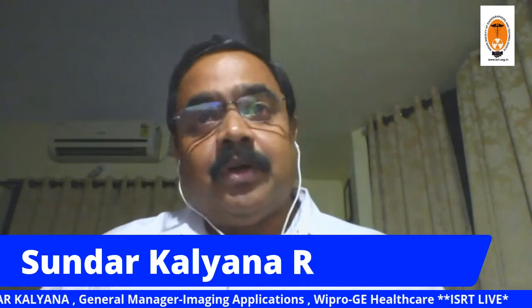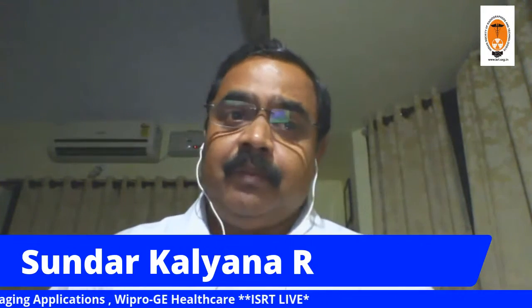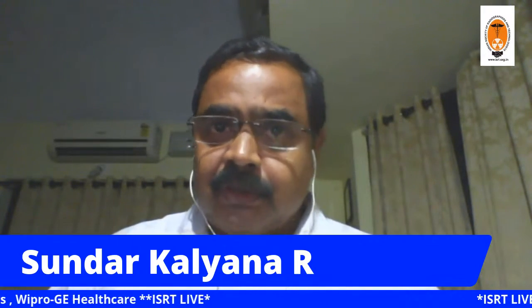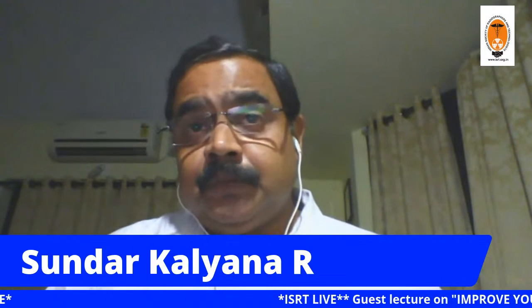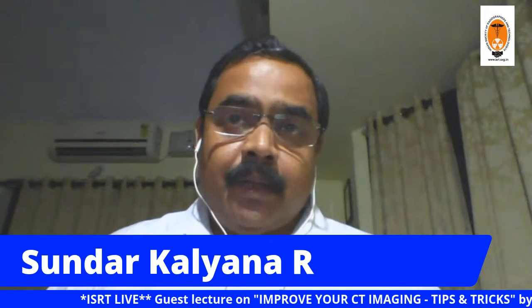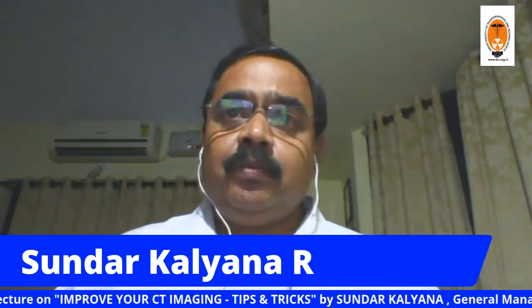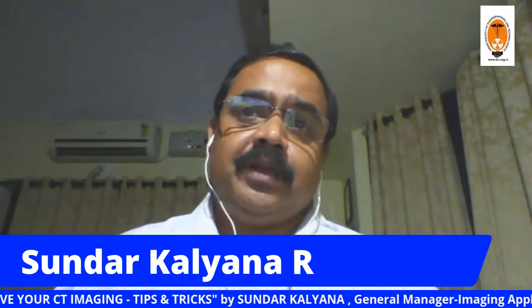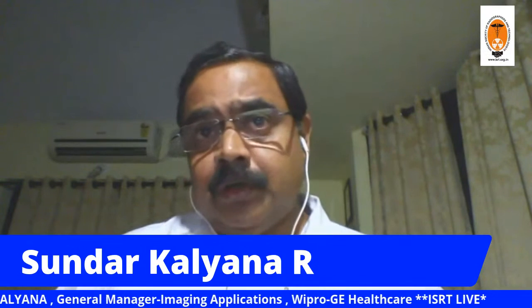As technologists, the most important thing is to use, as I said earlier in the slides also, the lowest possible kV, 70 or 80, depending on your system. And of course, use the right scan field of view. It depends on the vendor, depends on the system. If you have a pediatric scan field of view, please use the pediatric scan field of view. That will bring more homogeneity with a smaller field of view and will improve your image quality.